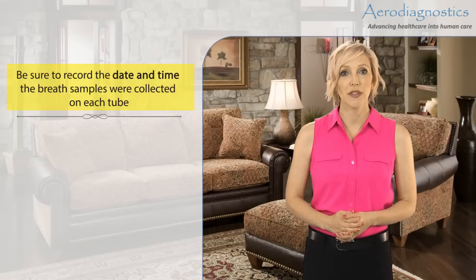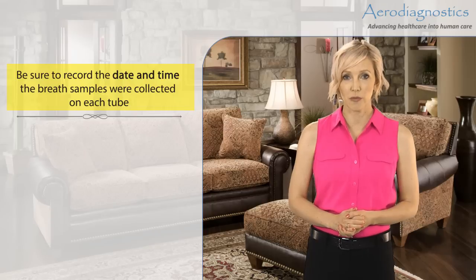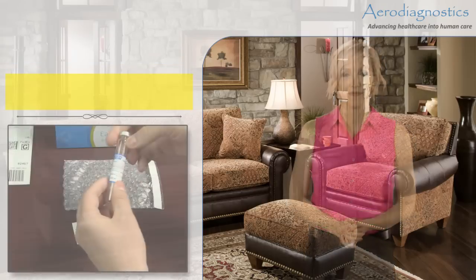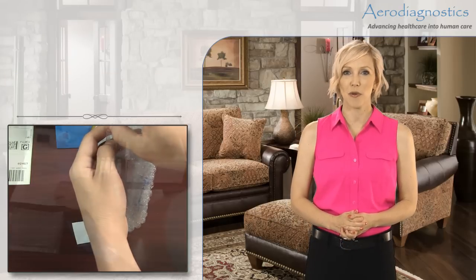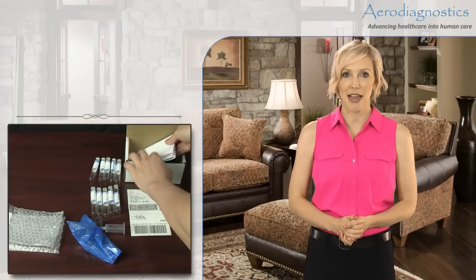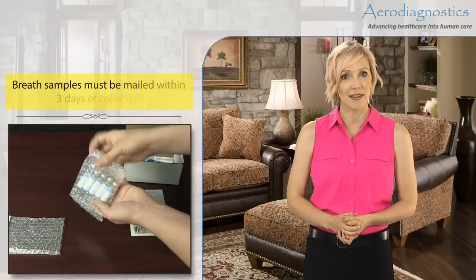For lactose, sucrose, and fructose tests, you will collect specimens number 2 through 7 every 30 minutes until all tubes are used. The test will take 3 hours in total. Step 7: Put the test tubes in the bubble bags provided. Place the bubble bags and the signed completed test requisition in the cardboard container. Seal the cardboard box with tape and return it using the prepaid postage sticker included to the Aero Diagnostics Laboratory for analysis immediately.